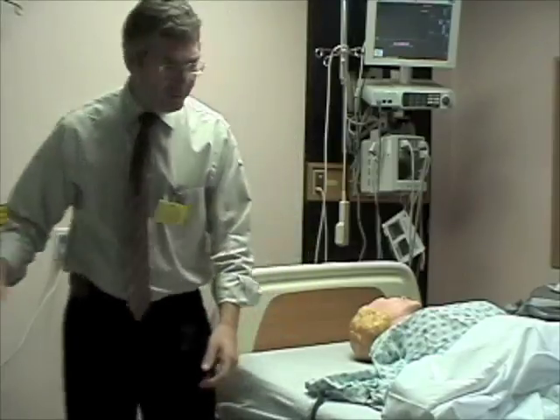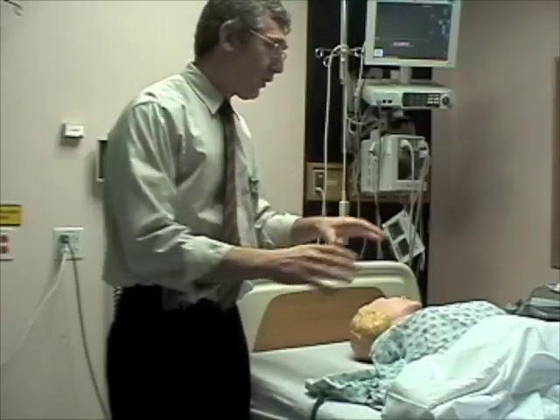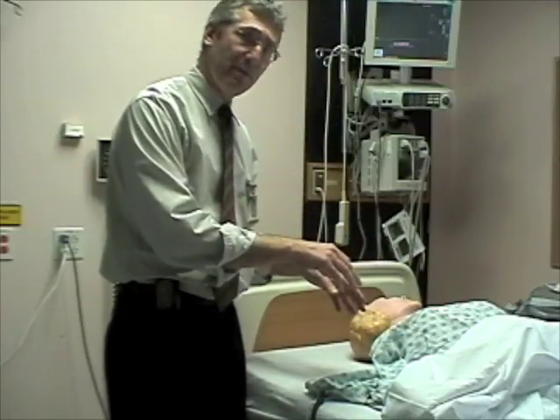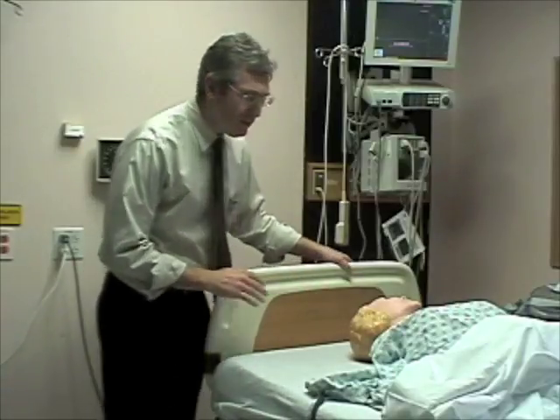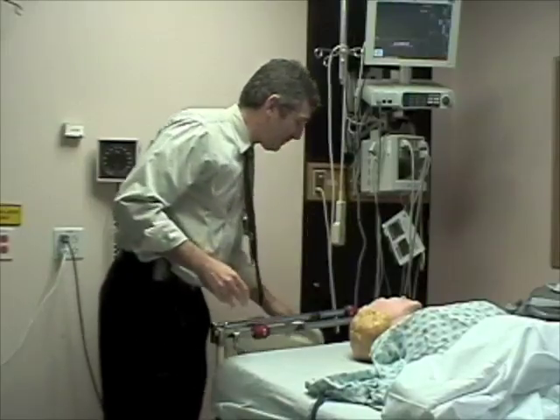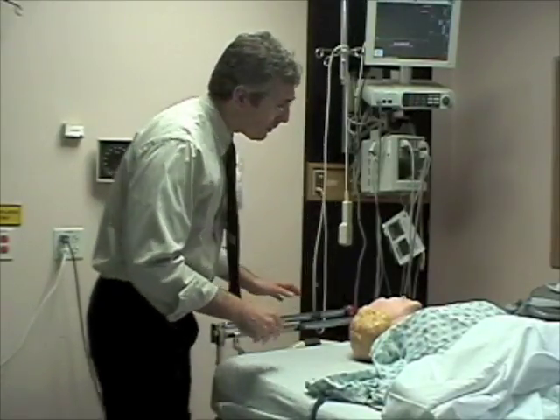So first of all, what you want to do is make sure the patient is comfortable and well sedated so that they can cooperate somewhat. The worst sterile technique is when the patient is reaching up into the field. So proper sedation beforehand. The bed position should be at a good height for you. Also, the head of the bed can actually be removed in most of the beds here at the Newt and Leslie Hospital.